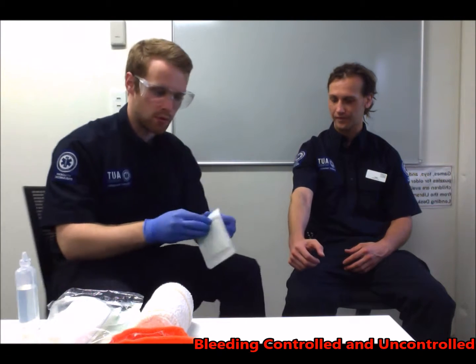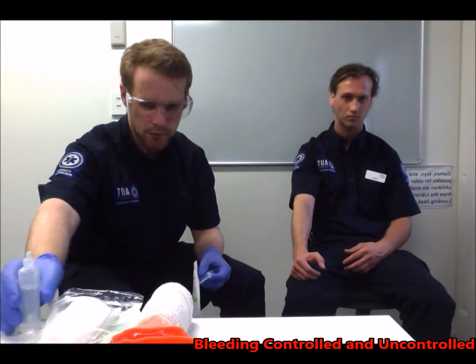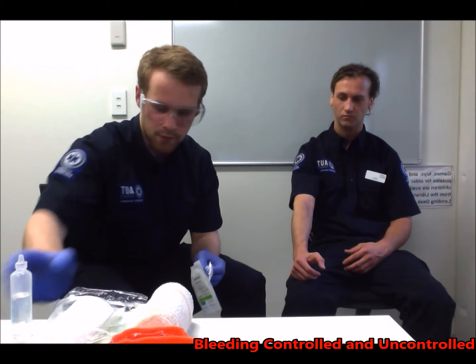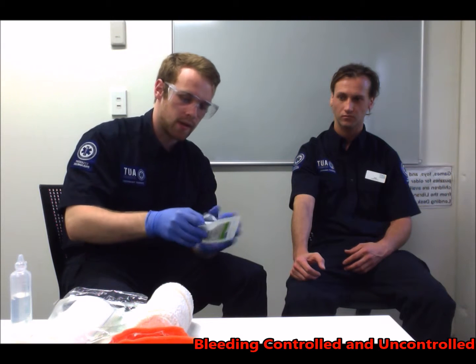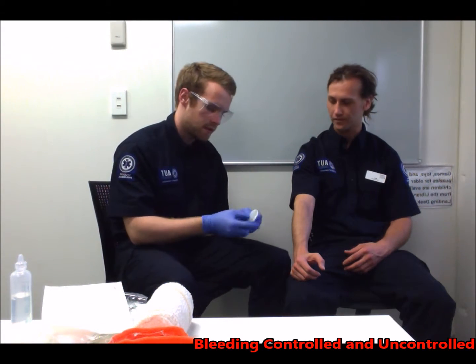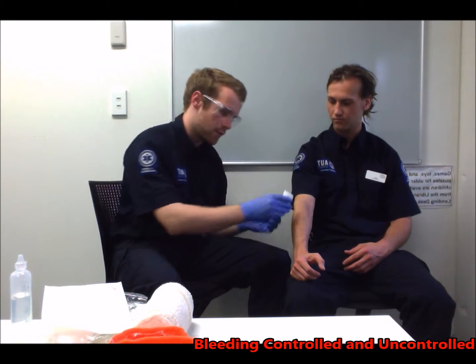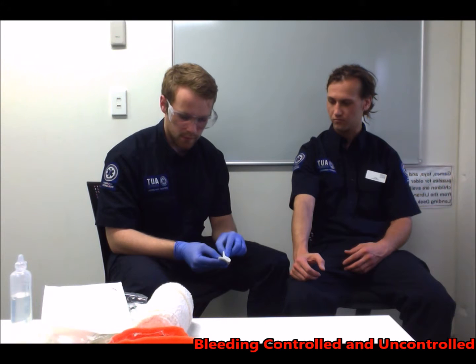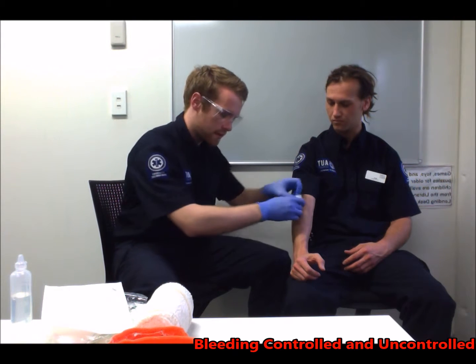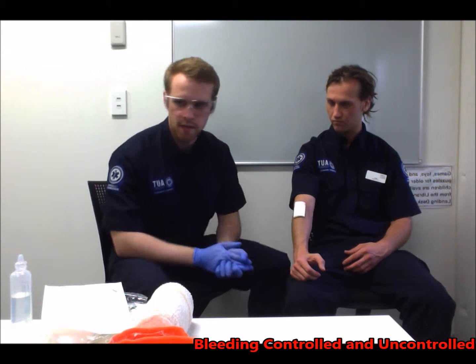So we just get some more gauze, some more saline, just to keep the laceration from drying out and keeping the gauze moist so it doesn't pull on the laceration. So I'm going to fold this up. We want to cover the wound with as small a dressing as possible. So we're just going to fold this up here. To apply the most pressure, we want the smallest amount of dressing.